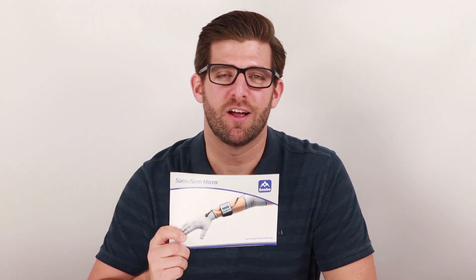Hello. Thank you for clicking on the Sabostim Micro Commonly Asked Questions video. In this video, we are going to cover some of the most commonly asked questions that we get about the Sabostim Micro. Every Sabostim Micro comes with a user manual. Please reference this for more detailed instructions on how to set up, use, and store your device.